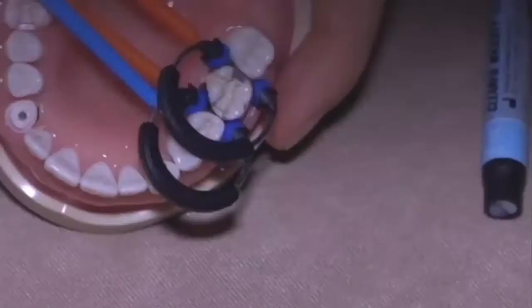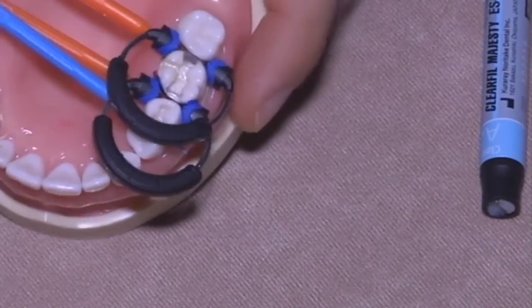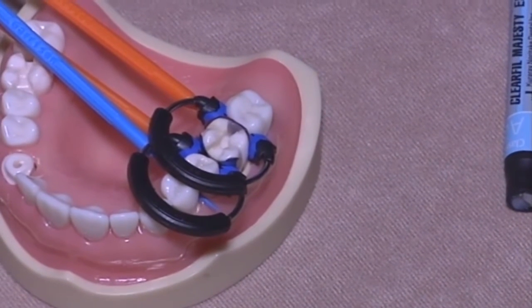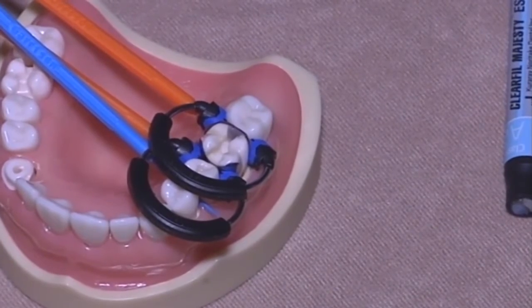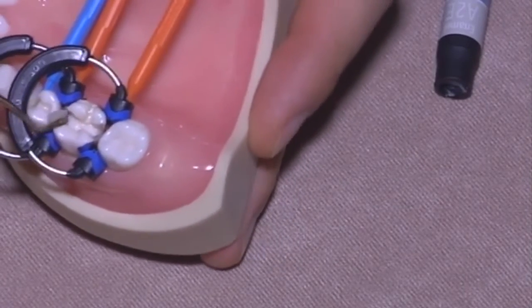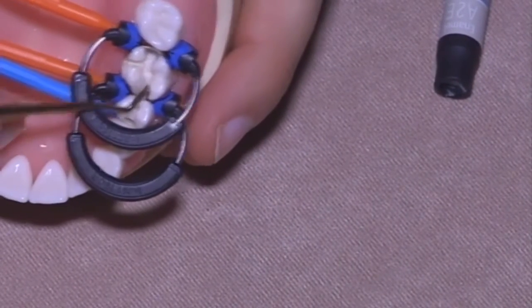Once you have these, light curing, just to fix it. In reality, don't save time with light curing. I think I told you 10 times today. And then again, enamel shades on the mesial wall.